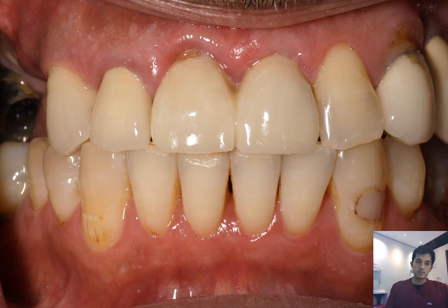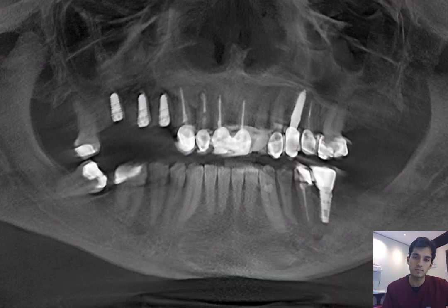So this was the clinical situation, having removed the posterior right bridge. And we can see the upper central incisors here. There's a bit of erythema around the gingiva, and those were the teeth with the periapical pathologies. Because we were starting with the posterior maxillary right quadrant, we started off just with the root canals on these two teeth to keep the infection at bay and prevent it from getting any worse.